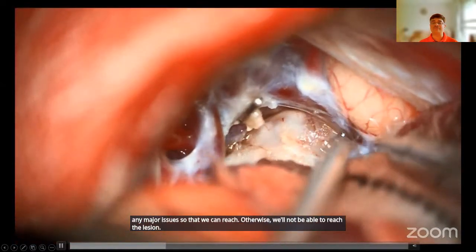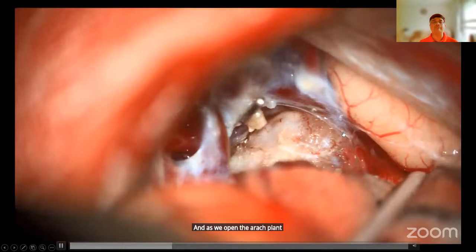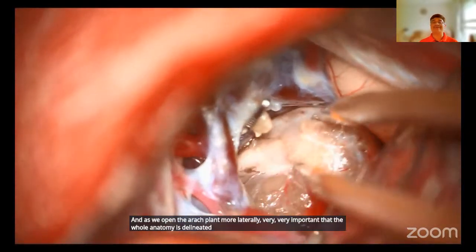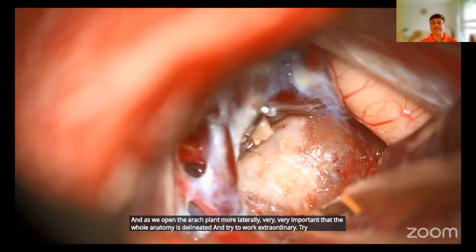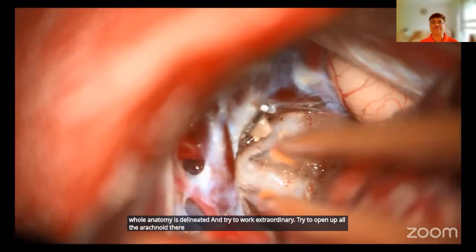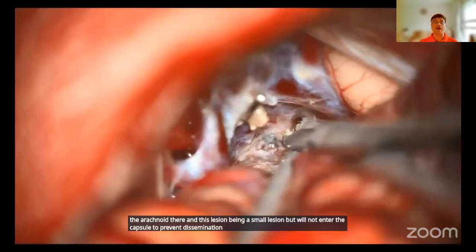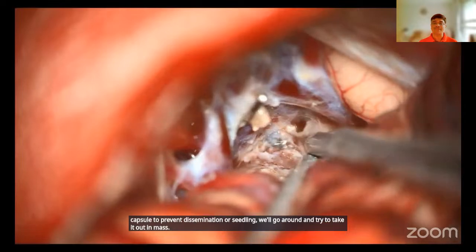And as we open the arachnoid more laterally, it is very, very important that the whole anatomy is described and delineated. Try to work extra-arachnoid, and try to open up all the arachnoid there. This lesion is a small lesion, and we will not enter the capsule, to prevent dissemination or seeding. We will go around and try to take it out en masse. So this is the superior aspect.